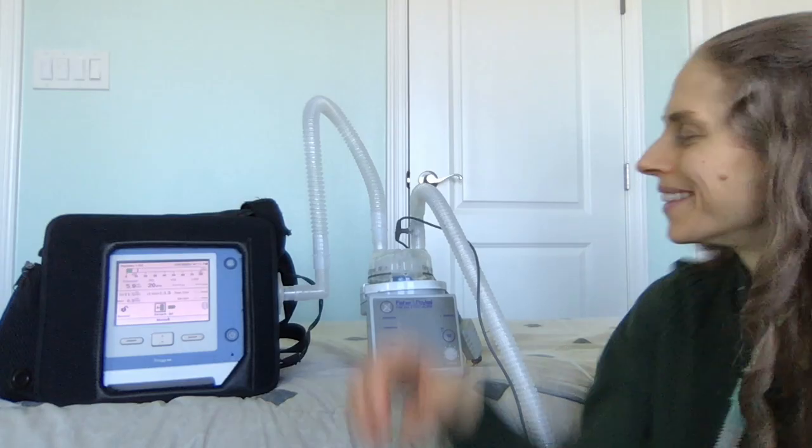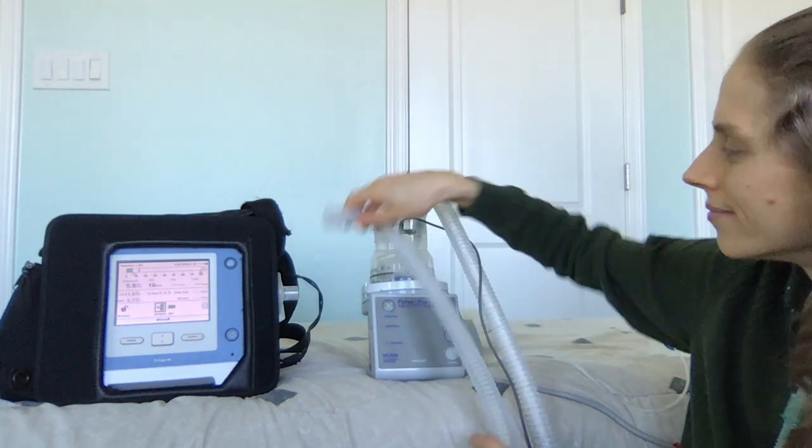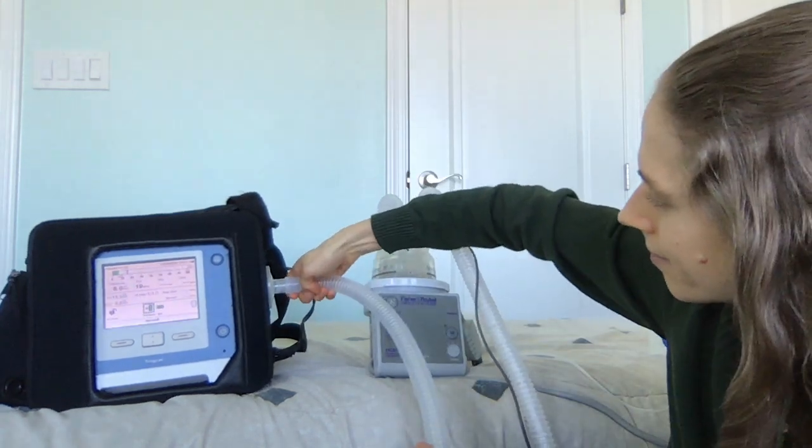If the ventilator can run on battery, please disconnect the power cord and run the machine on battery. If the ventilator must be plugged in, remember to protect the electrical cord from getting wet. If you use a heated humidifier, it is best to disconnect from the heated humidifier and switch to using a dry circuit.